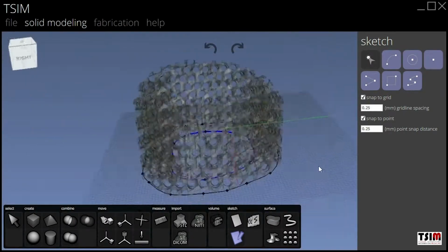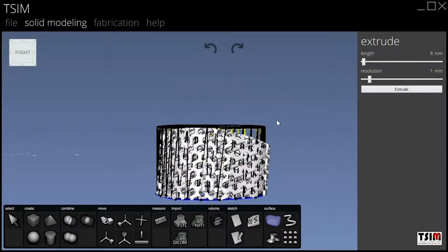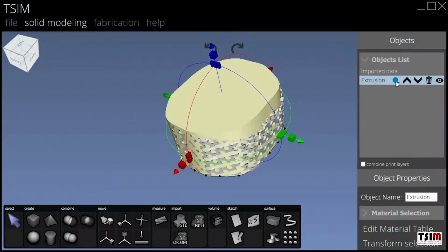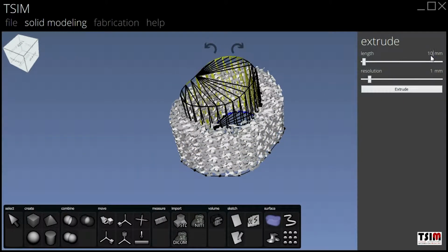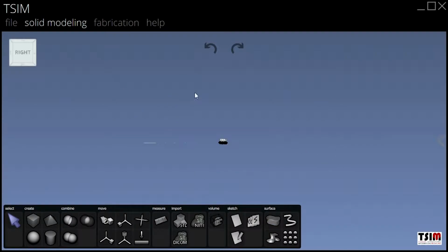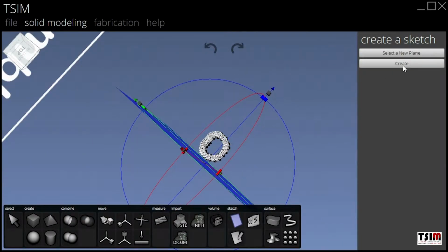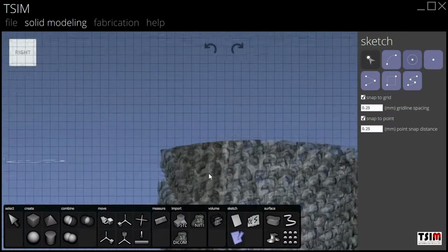Here the technician has started to make that model. We have the structure and the object in the computer space. We are adding the shape to it to get the proper dimensions and geometry.